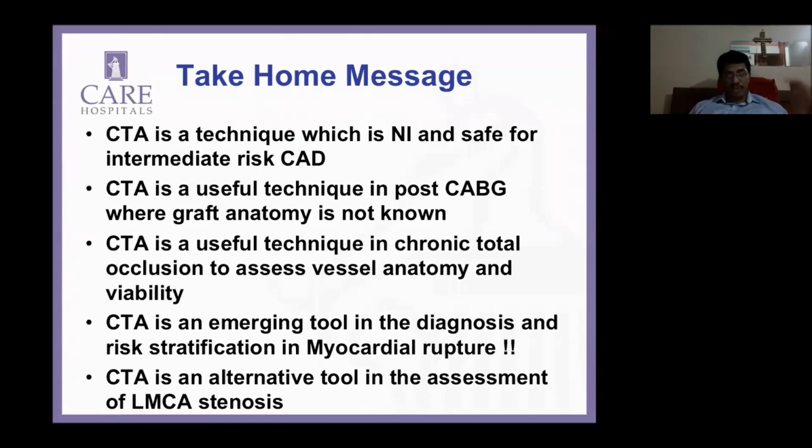Siemens is now coming out with a tool right in their workstation. Possibly it will hit India two or three years from now. They have just the demo model, which I had a chance to look at. Right now, it's pretty expensive. Everything has to be exported to the US. They have the market, they have the monopoly for that. In Canada, one of my friends is doing it, but again, it's off-label. But if it comes in, I think it's going to be a huge, beautiful tool where after a CT, you either keep that patient on optimal medical treatment, or he comes straight to the cath lab and you know exactly which vessel to fix, you know the length, you know the area, everything is done for you. So I think it's a great tool for us as cardiologists.